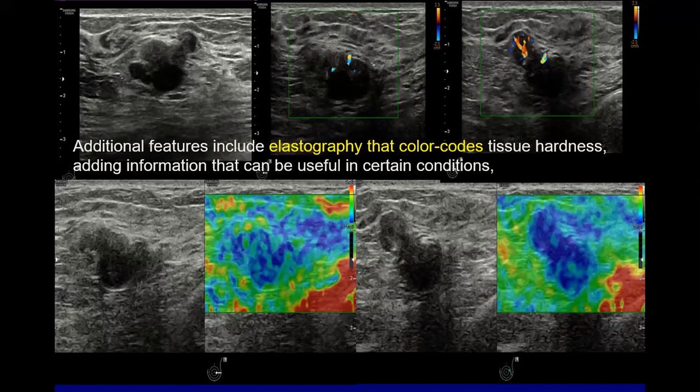Excellent. You are excellent. Well done. Excellent. All right. So even what is apparently cystic here is hard. It appears hard on elastography. So this is mostly a non-cystic area, probably a necrotic part rather than just a cystic part. See, this is apparently cystic there. It is also hard and it is large. So elastography upgraded this lesion.